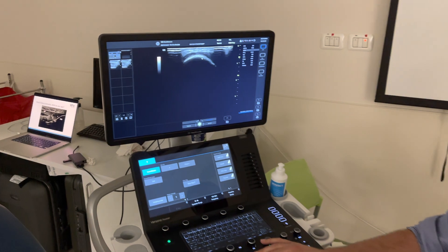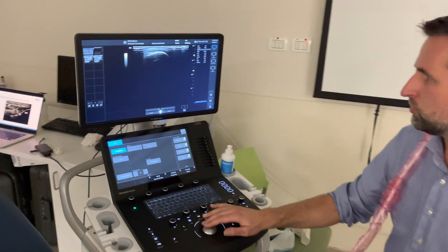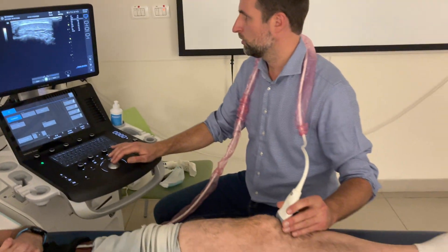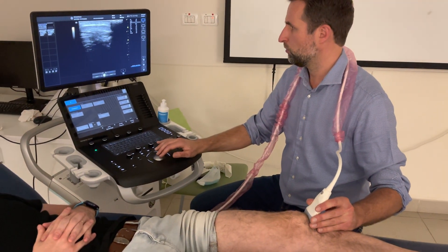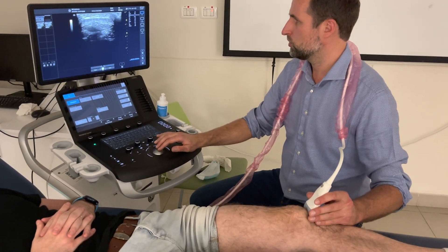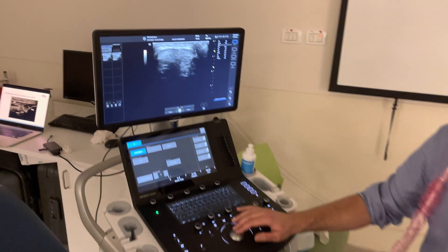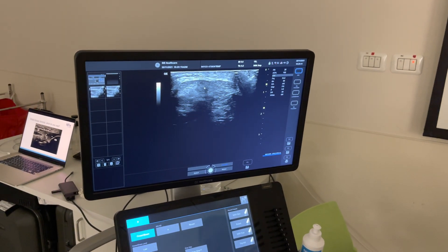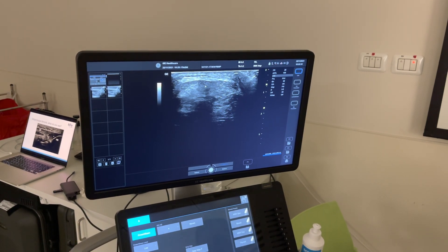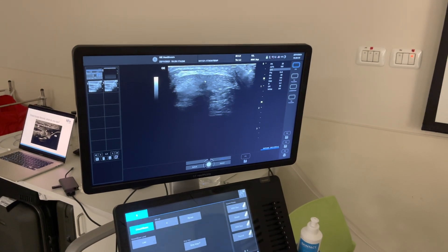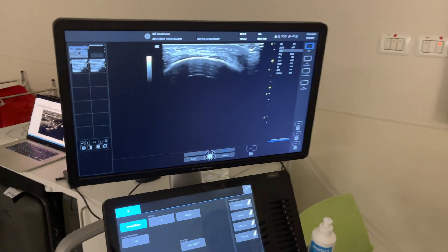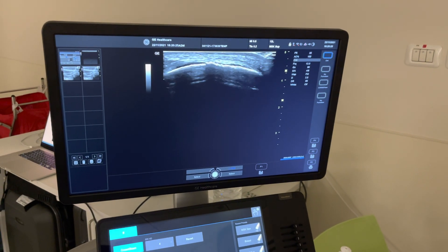Going a bit more distal, you can see all the last fibers inserting at the tibial tuberosity. Going back proximal to the mid portion and further up — the fat pad is visible below. Going up proximal toward the patella, the fibers start to angulate again, so you get a little bit of anisotropy here — that's normal, not directly a pathology. Going further up, the tendon becomes quite thin and then it's gone.